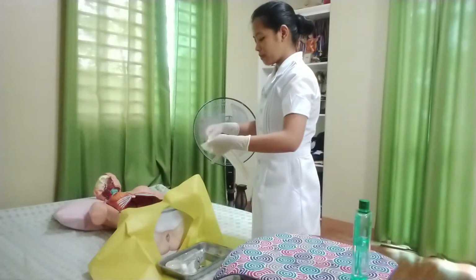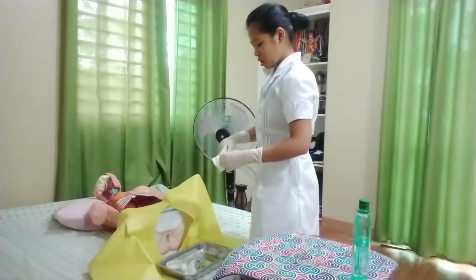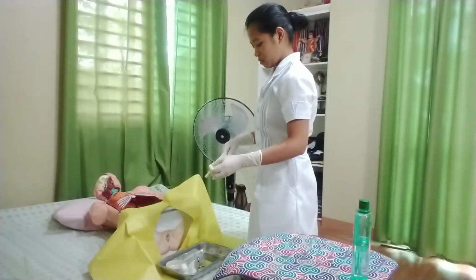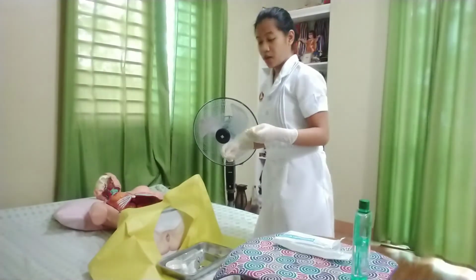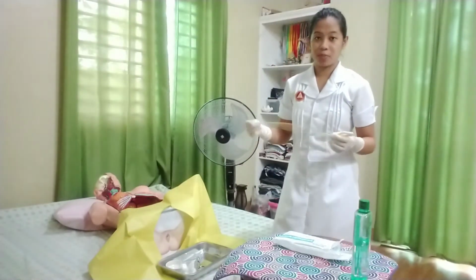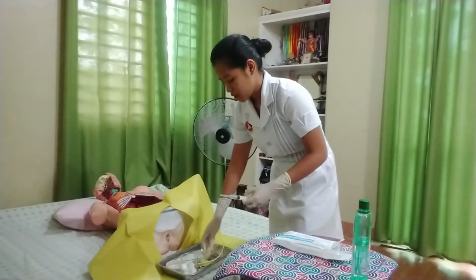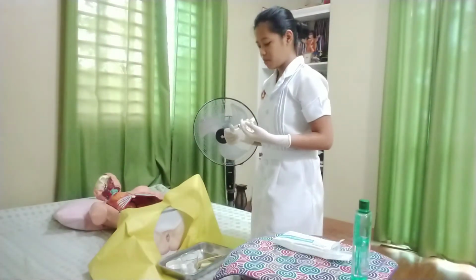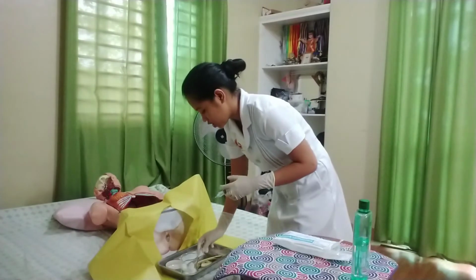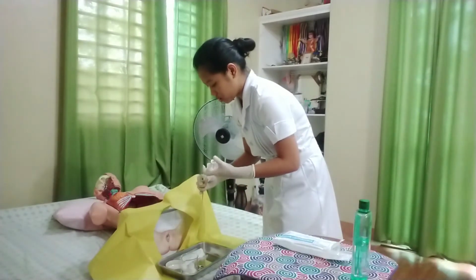So we will check the catheter. First we will check the balloon of the catheter to see if it is inflating properly. So we will have here the syringe prefilled with sterile water. We will remove the cap of the tip of the syringe and insert it into the injection port.